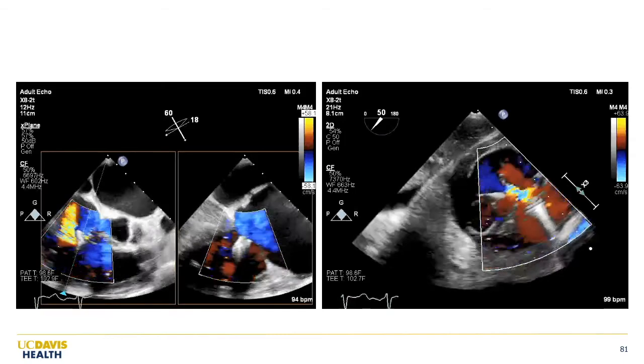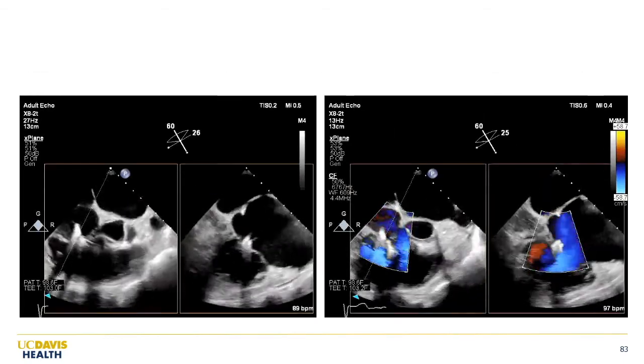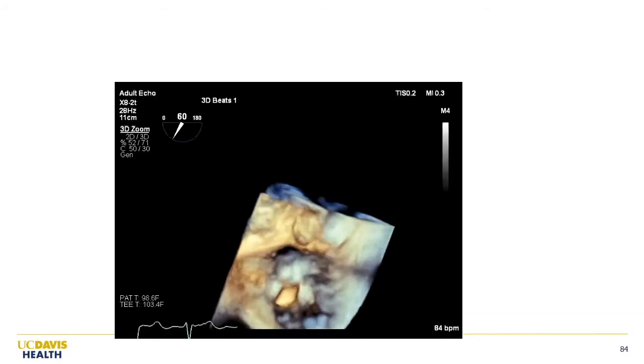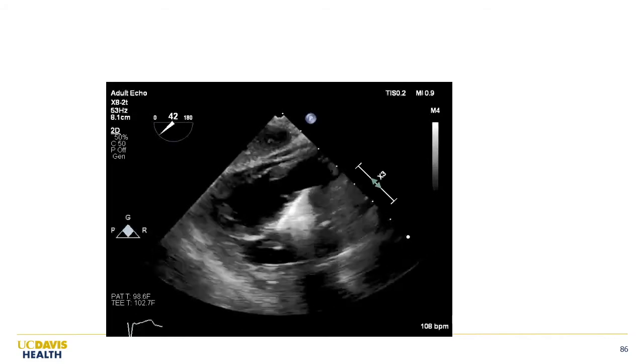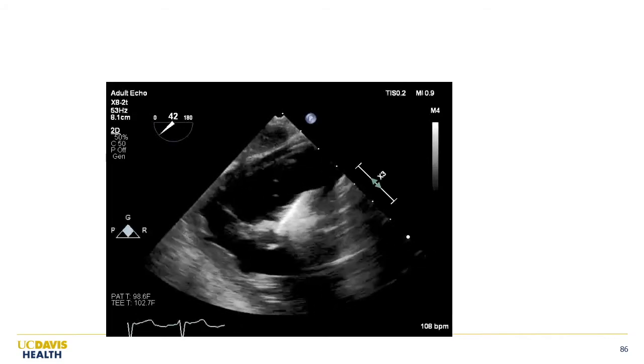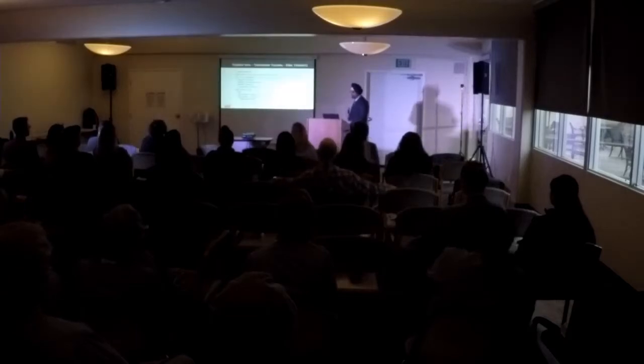So one clip is in, bring the second clip in, and in a very similar manner, the clip is attached to the leaflets, and then when you assess by color, you don't see that giant color mosaic pattern anymore. Again, here you were seeing that giant color mosaic pattern, you don't see that anymore. And this patient makes it out to 6 months and feels a lot better as a result of the therapy.